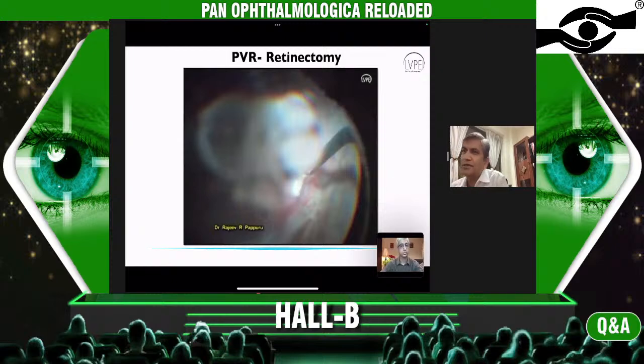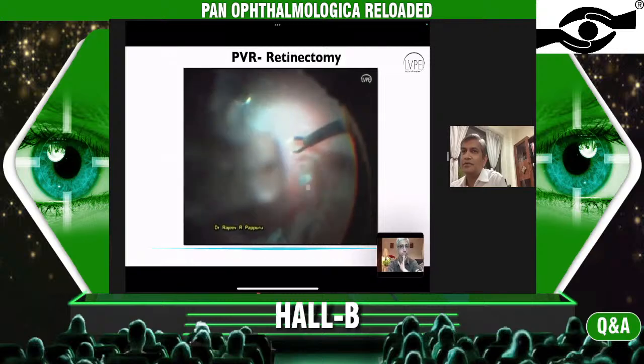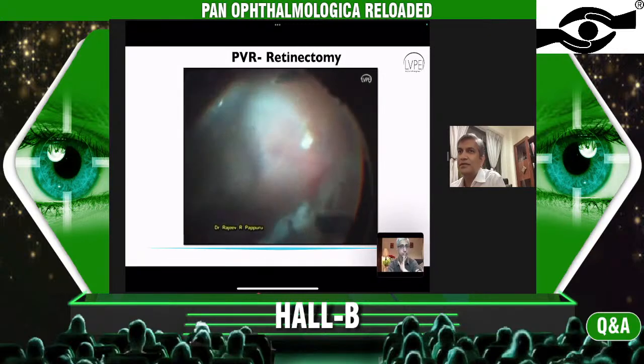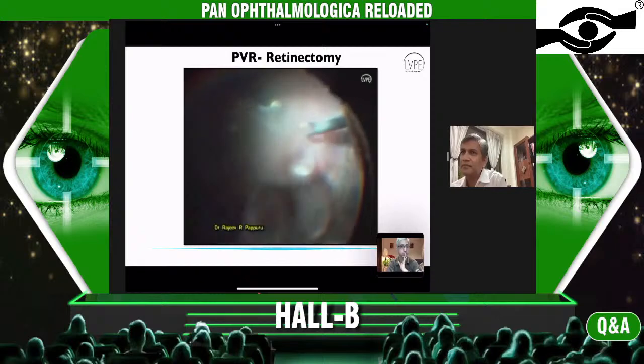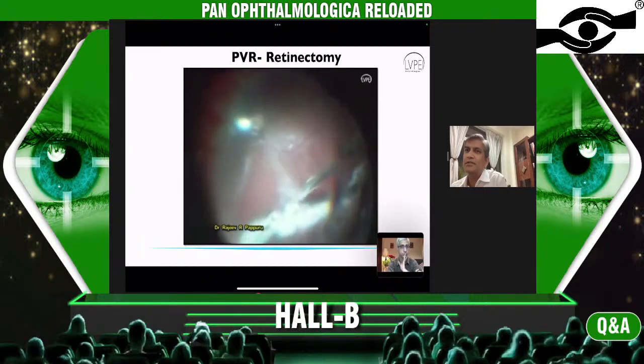So we dealt with the pre-retinal membranes, anterior proliferation, subretinal membranes. So you removed all the membranes as far as practically possible. So now you're left with a retina which you should be able to settle easily. But what happens is this is a case of trauma with corneal scar, and we're trying to settle the retina, removed all the membranes. But once you have removed all the membranes, when you try to look at whether you can still settle the retina, you see the retinal folds which are still fixed, and that's something which might not let you settle the retina.